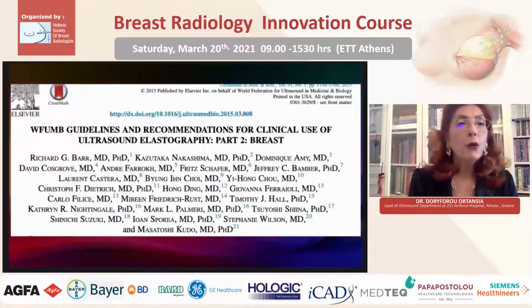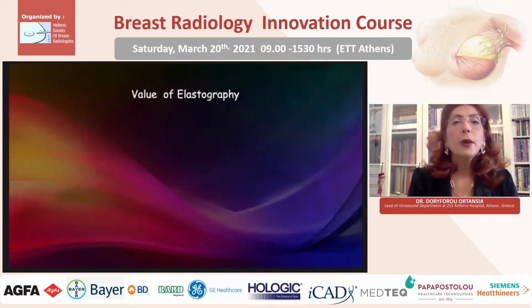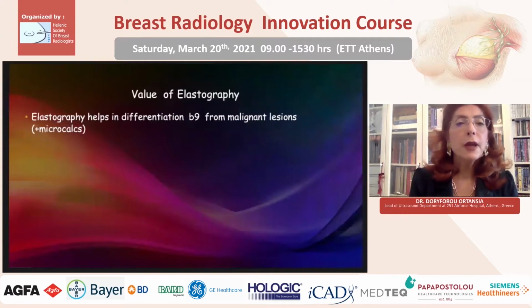We need to follow the guidelines published by the World Federation of Ultrasound in Medicine and Biology, and we need to incorporate elastography in our practice, given the cutoff values for characterizing benign from malignant lesions. So what is the value of elastography? Elastography helps differentiate benign from malignant lesions.